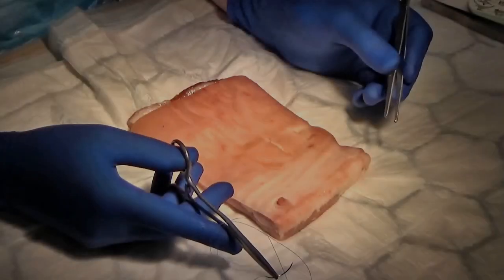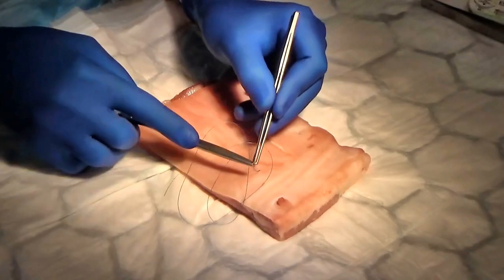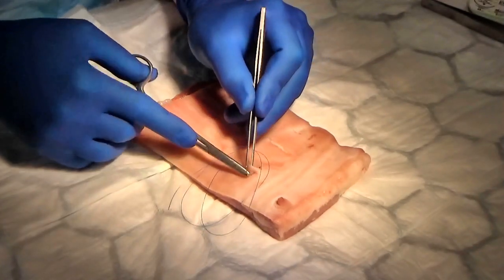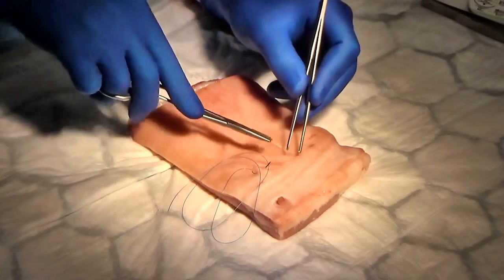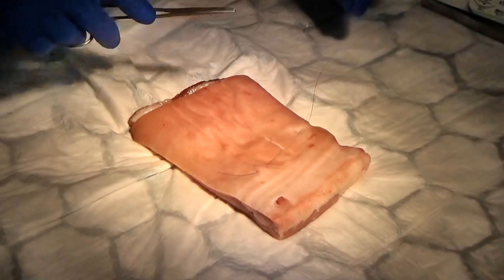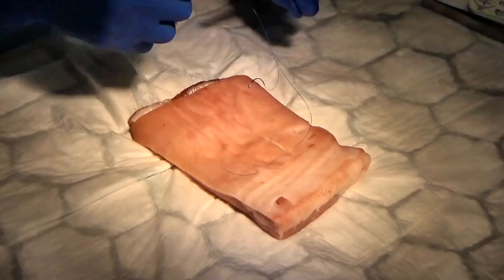So I'm going to briefly run through knot tying. So I'll just do this bit quite quickly, and we'll tie this first knot, and then I'll go on about suture placement in a second. So I've put the needle down, put it off to one side safely.